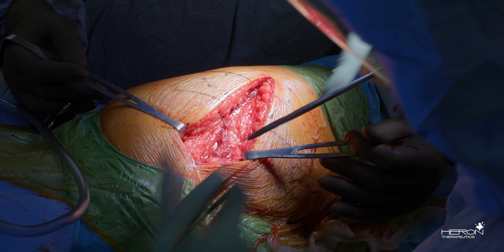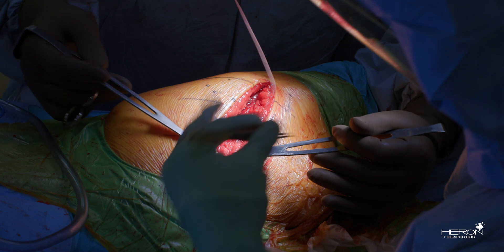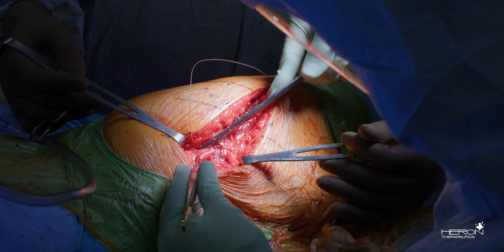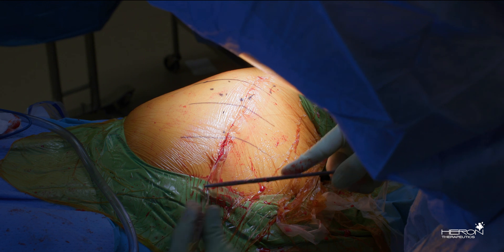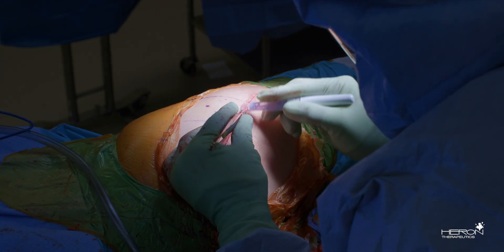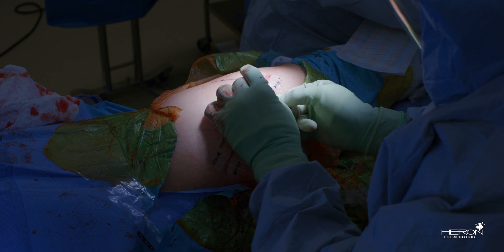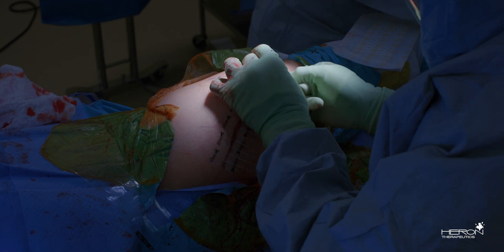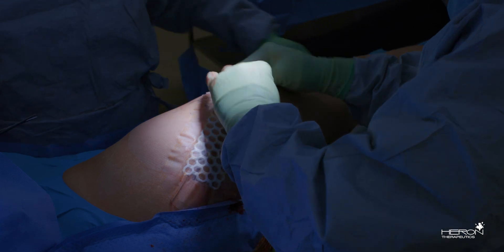Here we're closing the gluteus maximus fascia with a number one Vicryl in standard fashion, followed by a subcutaneous and subcuticular closure, which we're completing here, followed by application of our dressing system. Certainly any dressing system that you would like to use will work well with the Zen Relief.